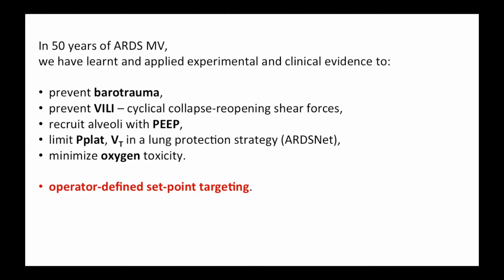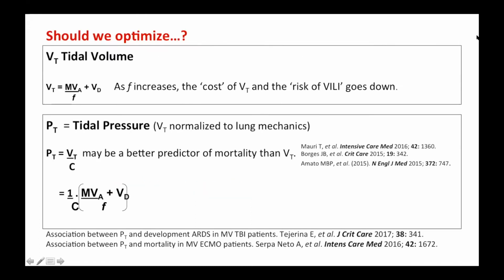And this whole collection really tells us that what we are doing is applying operator-defined set point targeting to our patients. All of them have some contribution to improving outcome and reducing mortality. So the question, when we are faced with all these proven benefits: what is it that we as the operator should optimize for our patients?